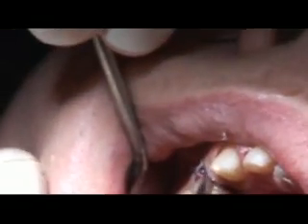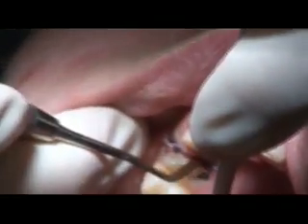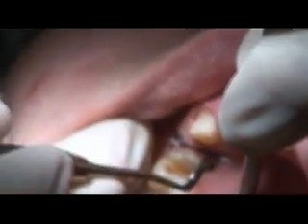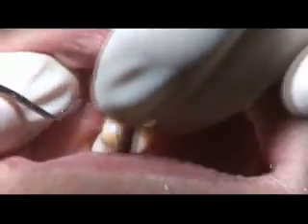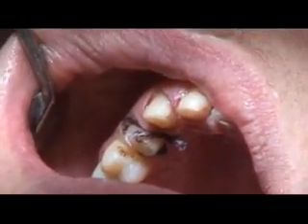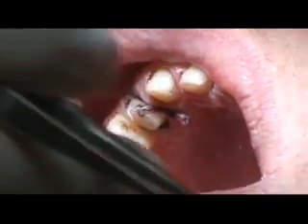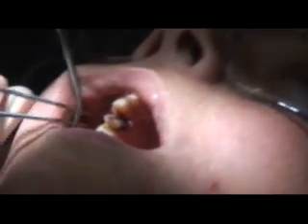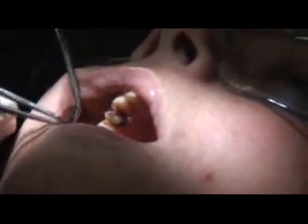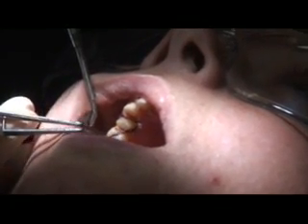Now we've got the cord in the sulcus, the large cord in the sulcus and the small cord in the sulcus. And at some point the doctor's going to want to take those cords out to take the impression. What I'll do is I'll take this large cord out now, and you'll see what a nice impression we have. Now we're ready to take our impression, and I'm going to pull the cord out, and you're going to see what a very nice tooth we have ready for the impression.